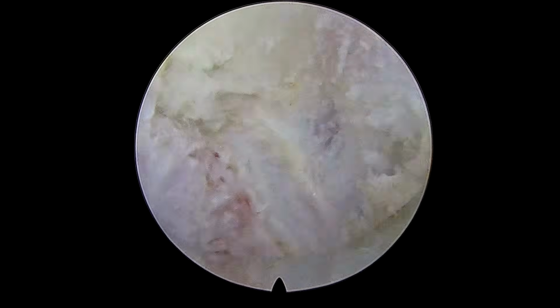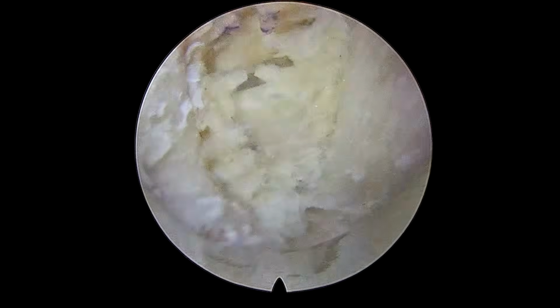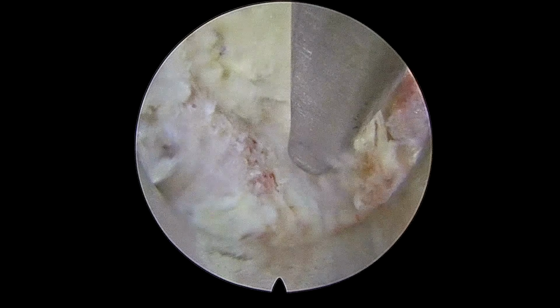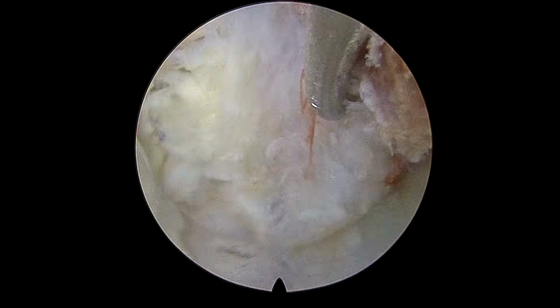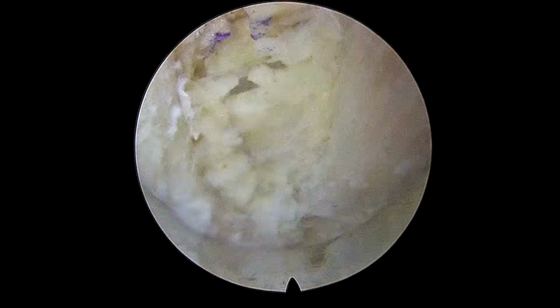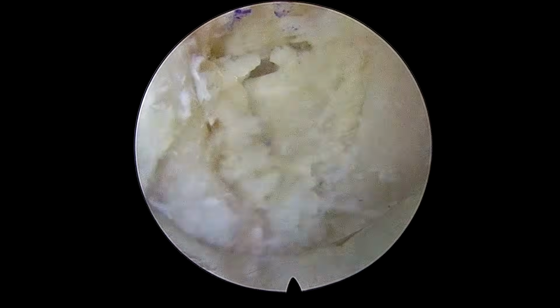Now we have completed our soft tissue dissection and identification of the landmarks. Now you can see here the V is very clear. This is the interlaminar space with the ligamentum flavum here. This is the inferior articular process and the joint. This is the inferior lamina here. You can see the bony landmarks are very well identified here. Now we can start our bony decompression.